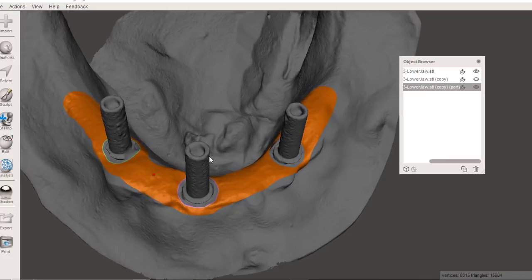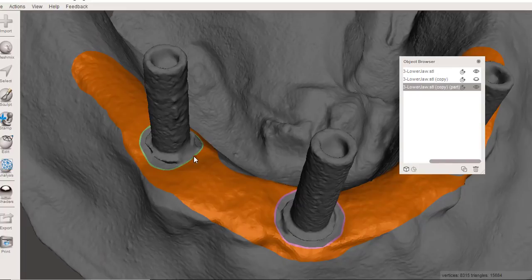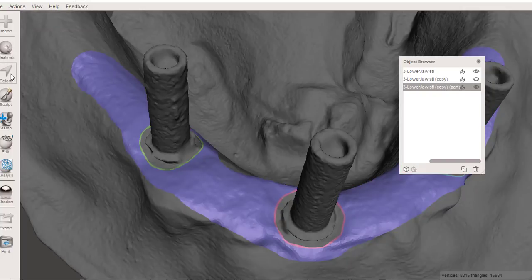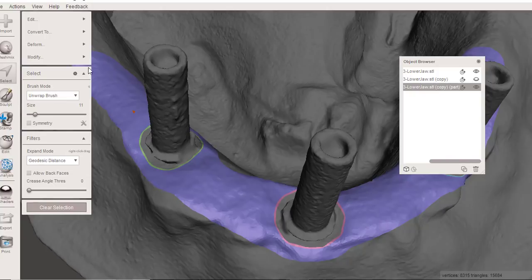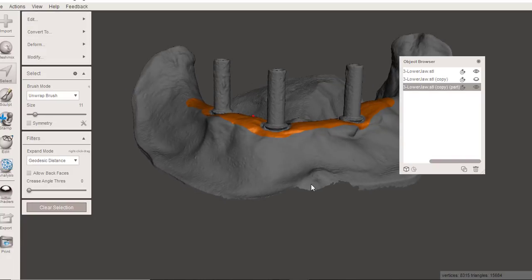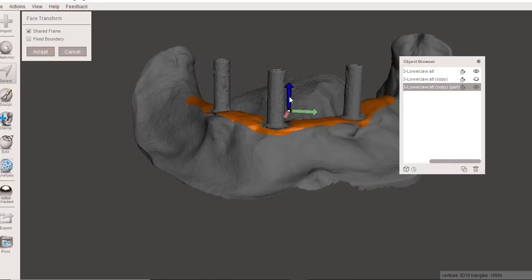Now I could double click on it, but since I just created some new face groups by clicking on those, now I'm gonna have to come in and double click these others. What you can also do is hit just one little dot and then go to modify and select all, and all of this STL is gonna get selected, okay? And now let's T for transform, and let's give this some three-dimensional shape.